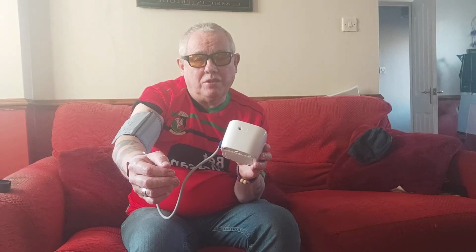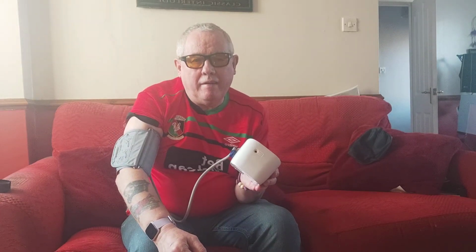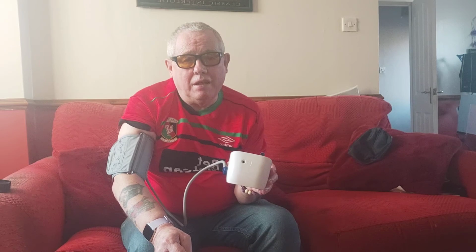And then if your blood pressure's high, like last week my blood pressure was high, and I phoned my doctor, and the doctor told me to write down readings, take my blood pressure 4 times a day, morning, lunchtime, dinner time, and bedtime, and to do that on the Friday, the Saturday, and the Sunday. One of my readings was actually amazing: 117/59, which was a low reading, and then the highest reading was like 145/95. So you know, it fluctuates. So the doctor was happy with the overall general average reading.